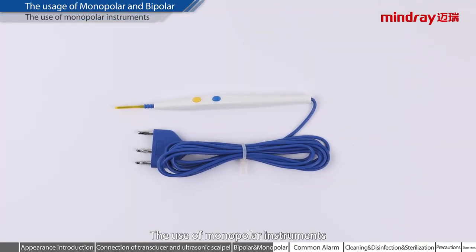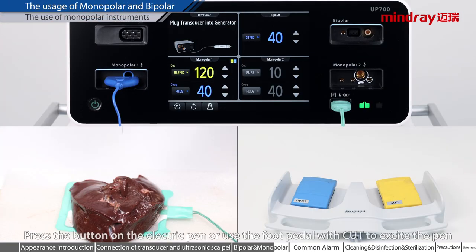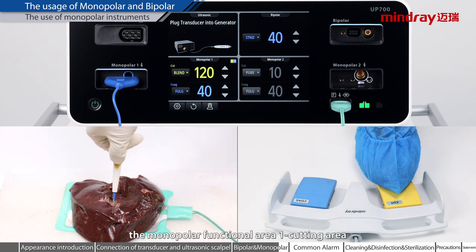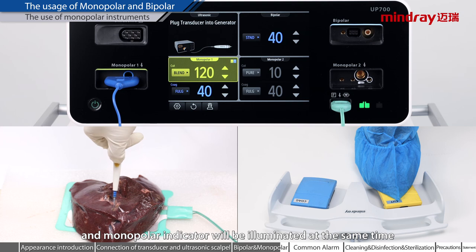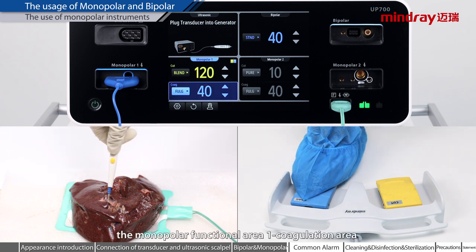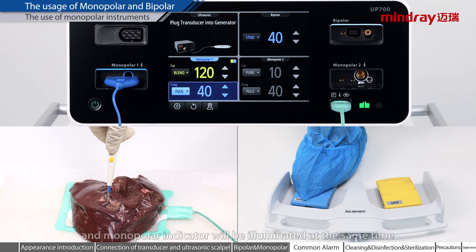The use of monopolar instruments. Press the button on the electric pen or use the foot pedal with CUT to excite the pen. When excitation is applied, the monopolar functional area 1 cutting area and monopolar indicator will be illuminated at the same time. Monopolar excitation can also be performed by pressing the electrical button on the pen or by pressing the foot pedal with coagulation, illuminating the monopolar functional area 1 coagulation area and monopolar indicator simultaneously.